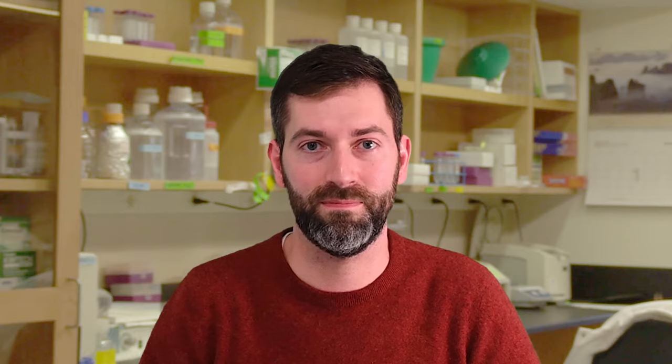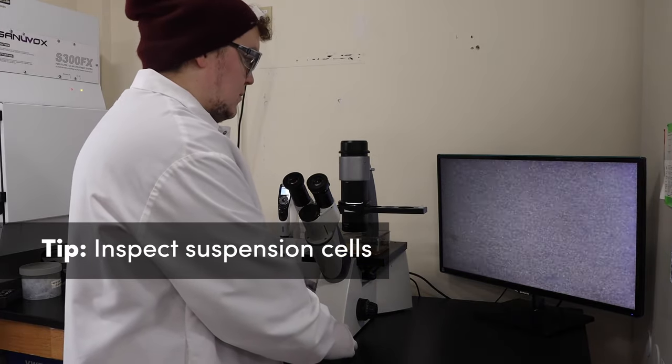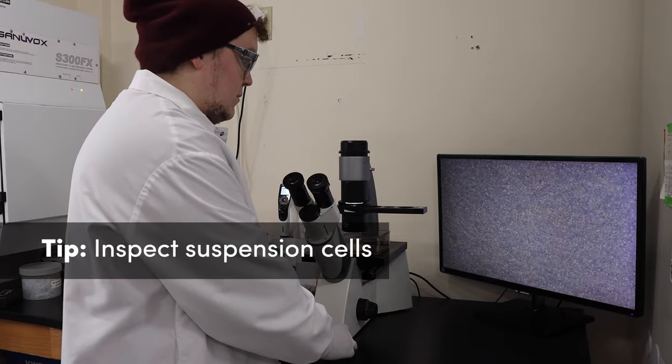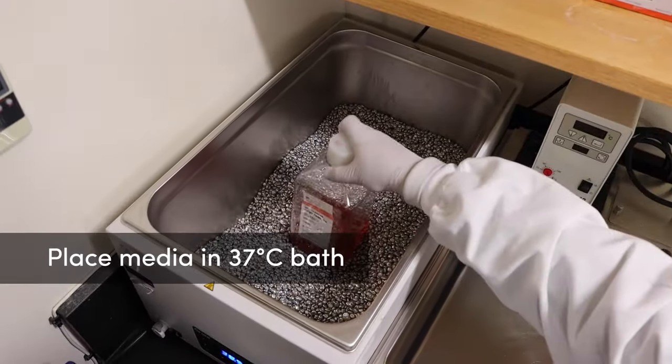Let's begin the demonstration. Inspect the health and density of your suspension cell lines using a microscope. If they are ready to be split, place a bottle of the appropriate media with any supplements needed in a warm bath.